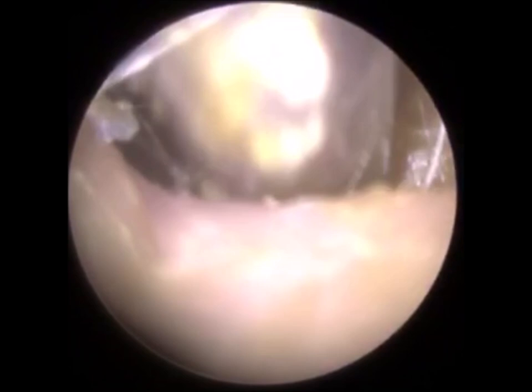And also, it's important to remember this patient attended with earache, so he was already in a massive amount of pain, and we weren't using any anesthetic, no local, no general. And you can just imagine how well he tolerated this procedure. You can see how hard we're working in here and how long we've spent in there and all this tugging and pulling and lifting of skin off the canal wall. And again, he was really cheering me on, just begging me almost to continue and just finish the job off for him.